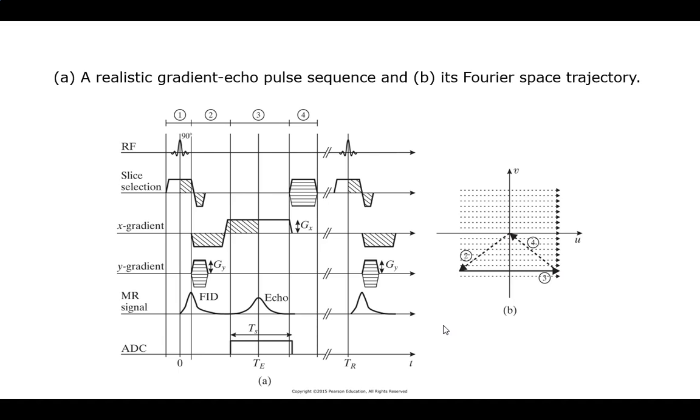On this one, before they do show this correctly, this is going to dephase that one and remove the effect. So it's nice and smooth. I avoid any of the oscillations right at the beginning as I change. But this one, you just give it time to naturally damp out because I don't want to reverse it, because I don't want to change my space.